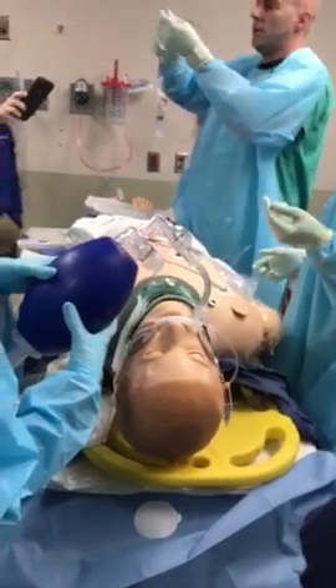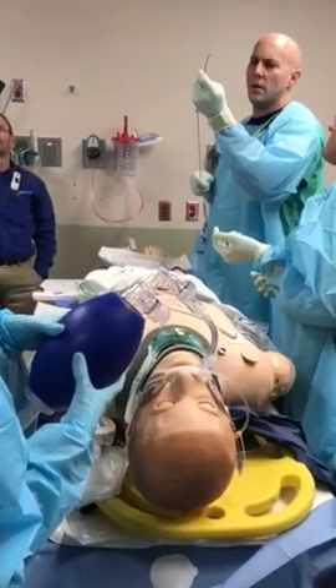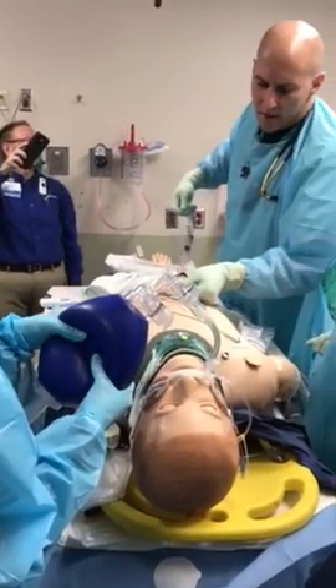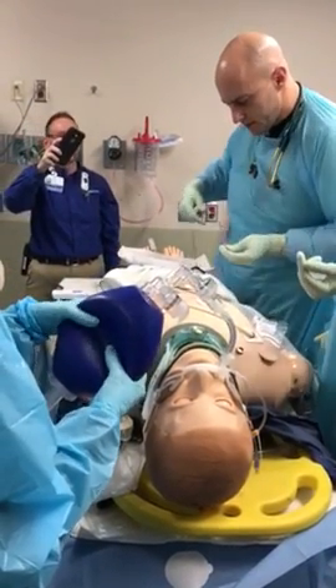The catheter out, the balloon — our balloon's flush too. Make sure that's measurable. Our device measurement is going to be from our xiphoid to our groin. It's going to be a 30 for this patient.